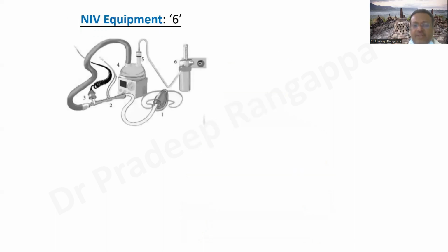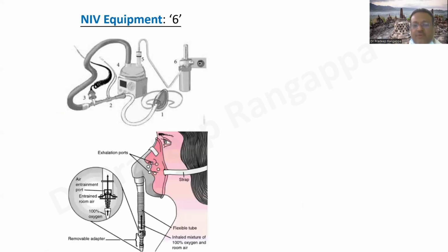So we'll just move to what are the equipments that are needed when you're using NIV. In ICU, when we use NIV, it is the ICU ventilators. We do not use home CPAP or home BiPAP for patients in ICU because in ICU, we understand that these patients are sicker. They may have a concomitant pathology. It could be pneumonia, it could be pulmonary edema. So it is expected that we use a proper ICU ventilator with a walled oxygen. One of the prerequisites is they should have a walled oxygen to deliver high flow gas flows.